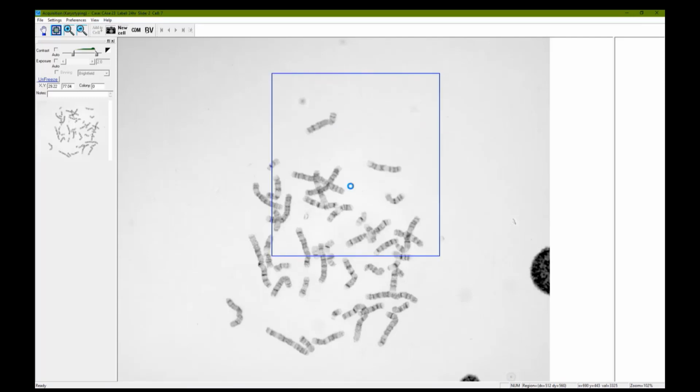Another point to remember is that the ASI's merge feature is part of the same software for time saving and ease of use, and there is no need to use external software features to merge the chromosome. In addition to this, you can add multiple chromosomes at any given time, which can be edited and dragged into the main window.